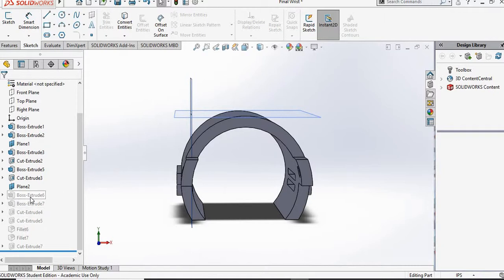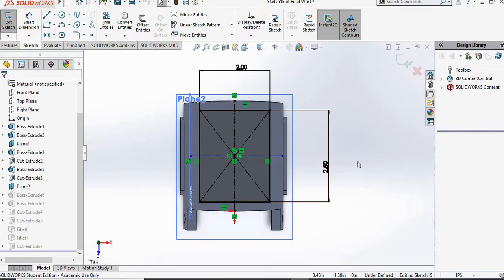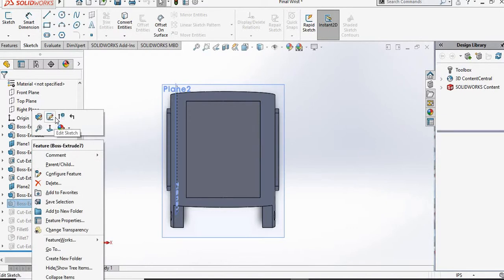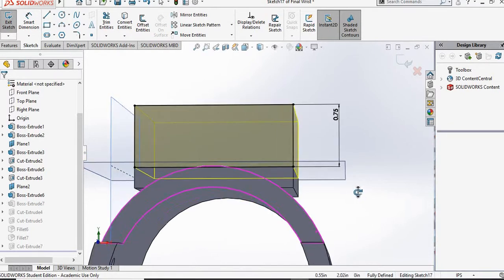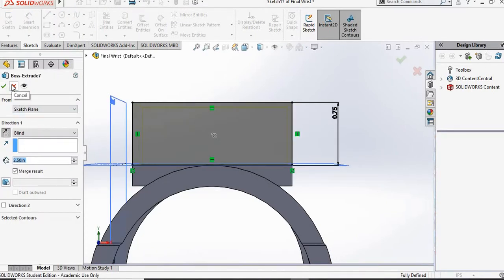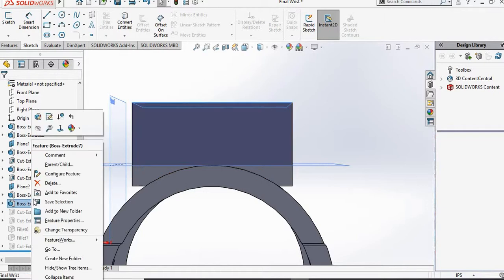And basically, what we added was a box with the following dimensions. So you go to our top plane, and make a rectangle with the following dimensions. Again, 2.5 by 2.0. And then we went ahead and created another box extrusion on top of our first box extrusion. So our first box extrusion was extruded downwards for 0.25 inches, while our second extrusion was extruded upwards for 0.75.